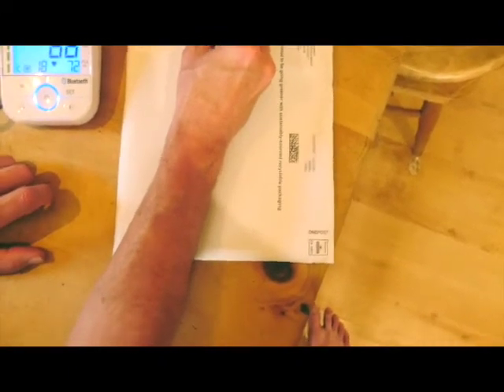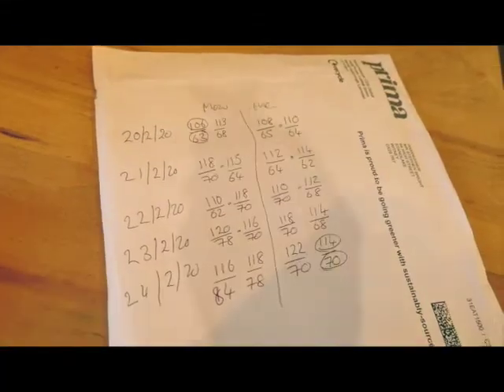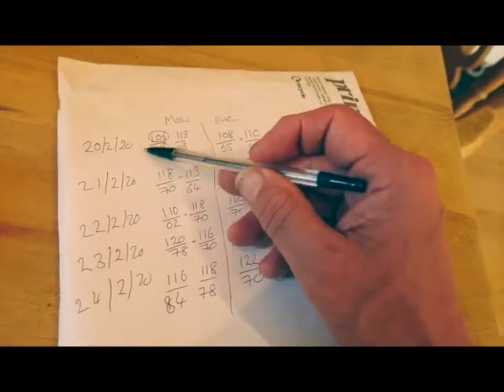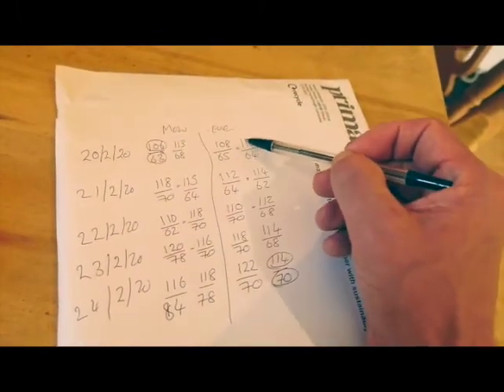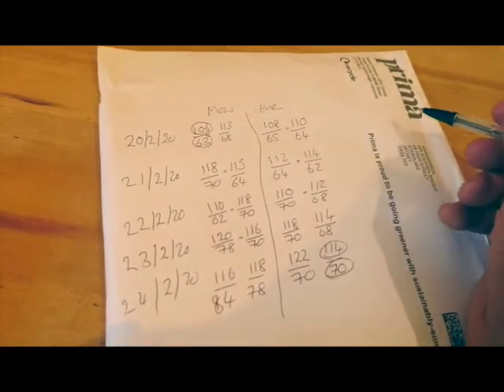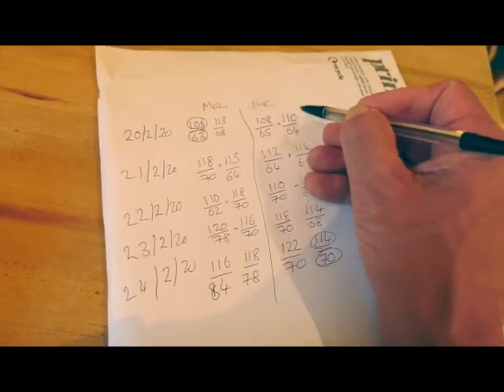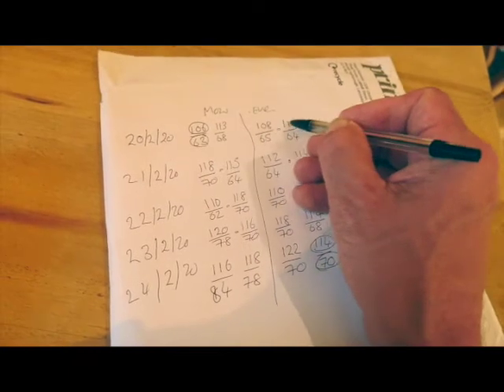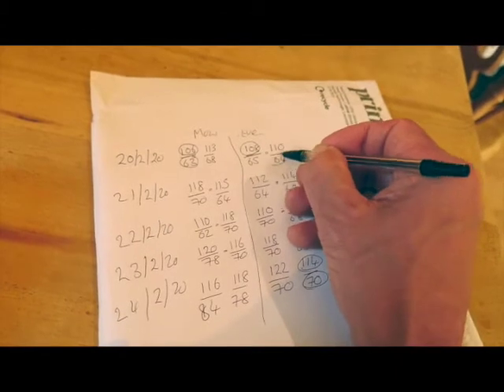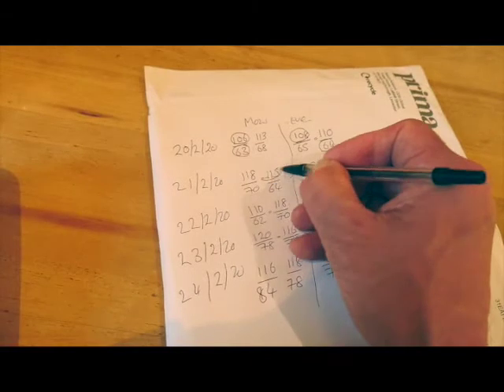And then in the evening you'll do your next lot. So over the course of about three to seven days, you write down your two morning readings and your two evening readings. And do that for, as I said, between three and seven days. Then on your piece of paper, put down the lowest number of the two for the systolic and the lowest number for the diastolic.